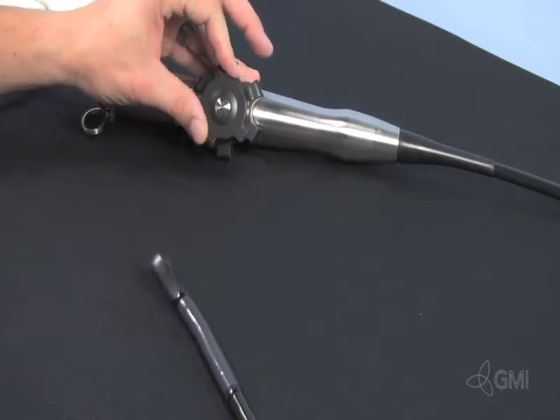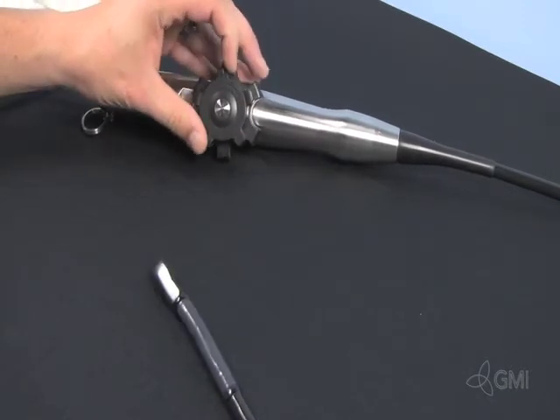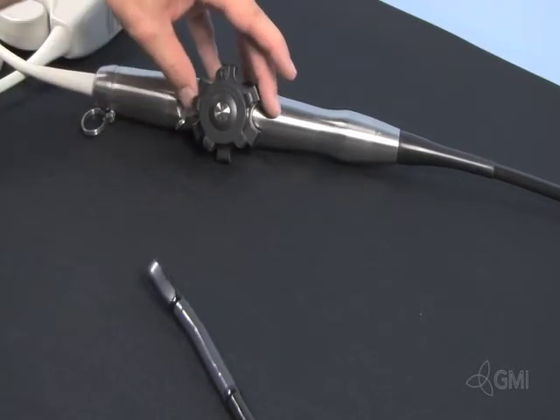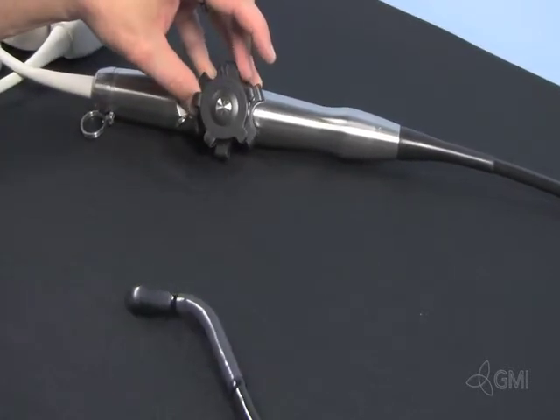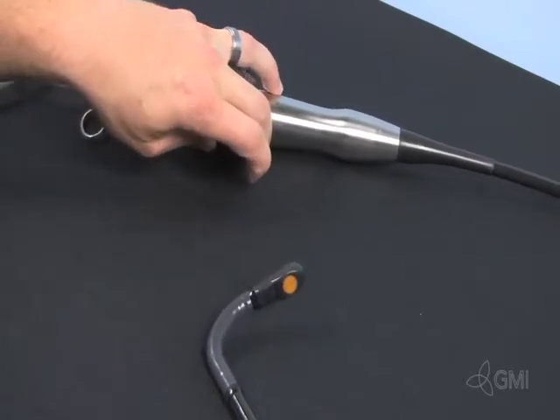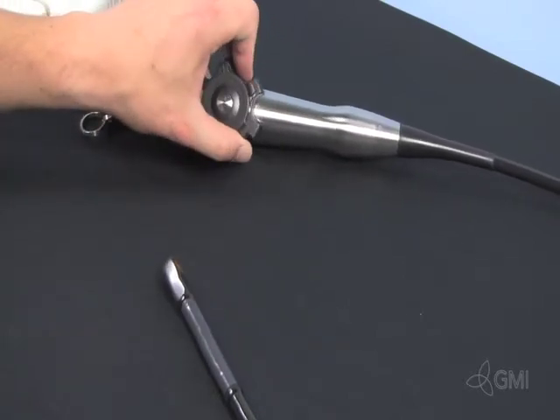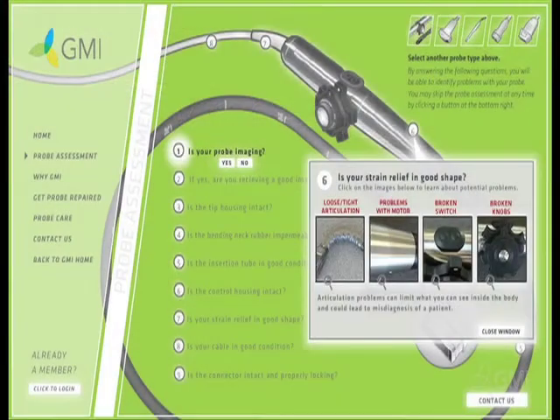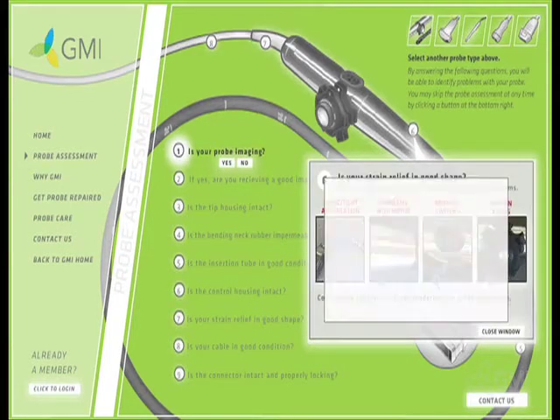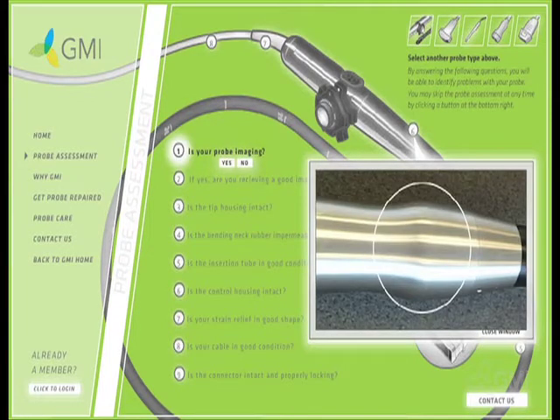The control housing allows the operator to steer the probe as well as the lens. These are all mechanical controls and should be checked thoroughly. Use the controls to check the up and down and side-to-side articulation of the probe. Steer the transducer from 0 to 180 degrees to verify motor operation. Verify articulation locks — there should be no drift.